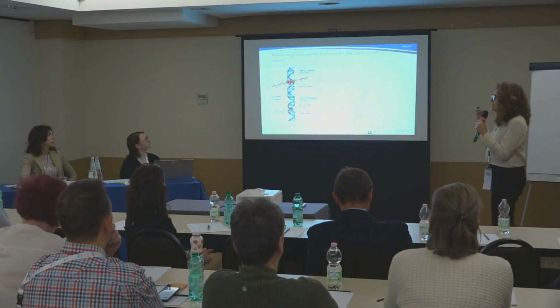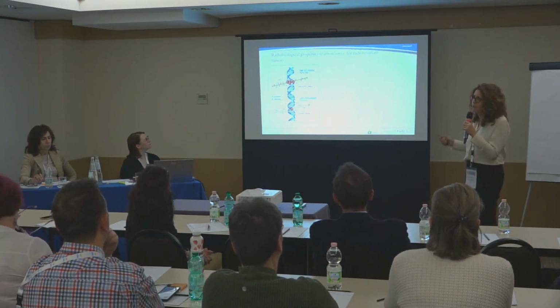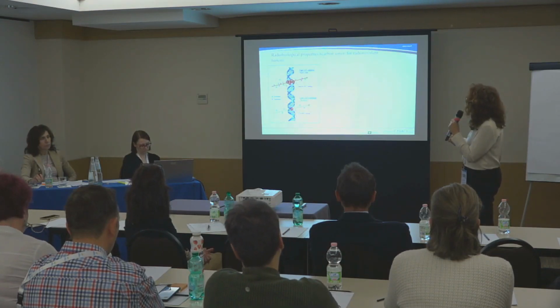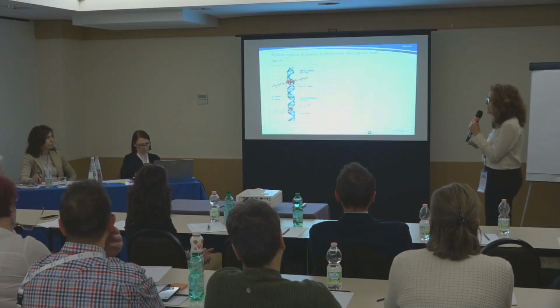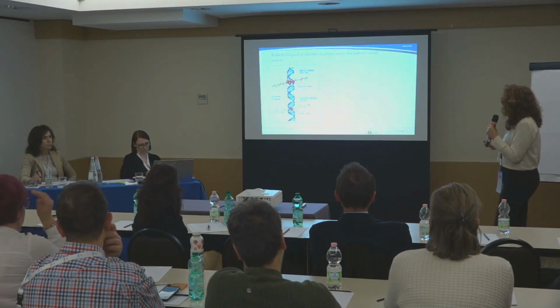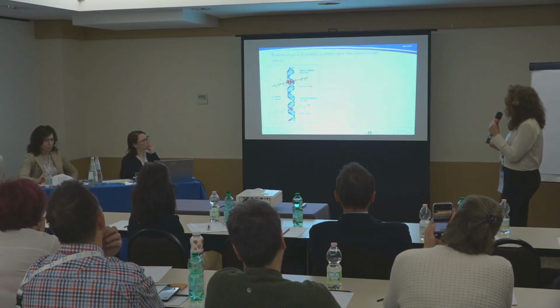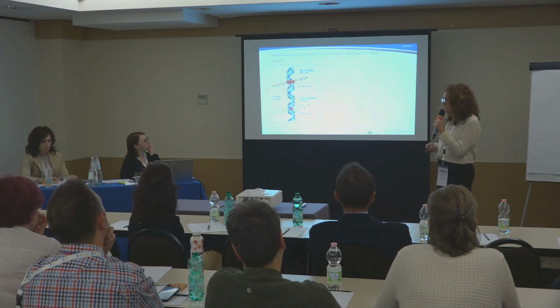Radiobiological properties are a typical characteristic of carbon ions, and they are very important for radioresistant tumors, so the majority of sarcoma tumors, particularly bone sarcoma. The radiobiological property consists in giving multiple damages in a short distance of DNA, and this distance is calculated to be less than the diameter of DNA. So you can see the difference in multiple damages between heavy ions, so carbon ions, and X-ray. These properties strongly reduce the repair mechanism of tumor cells.